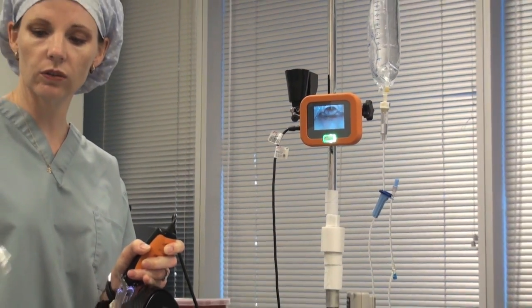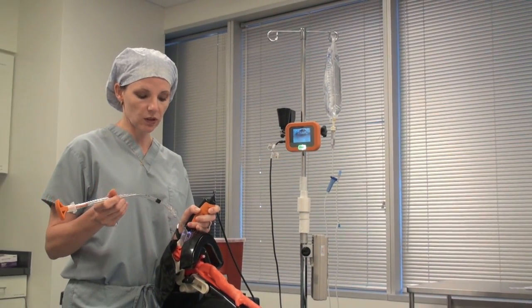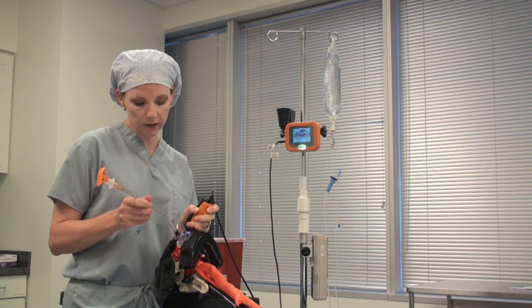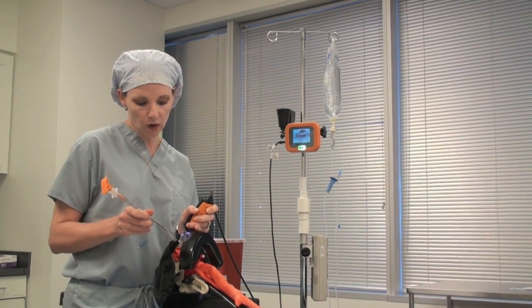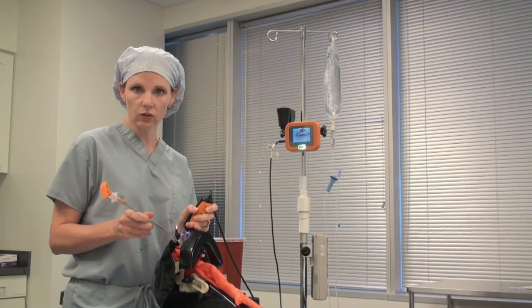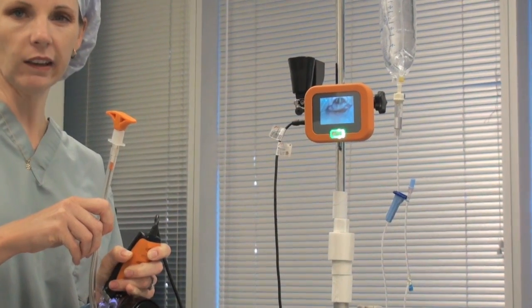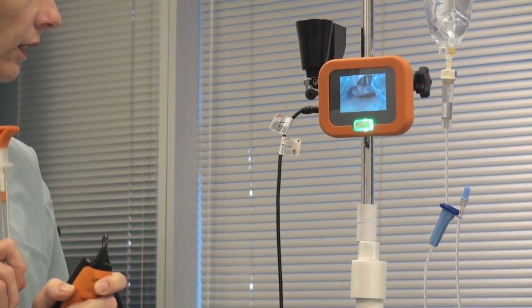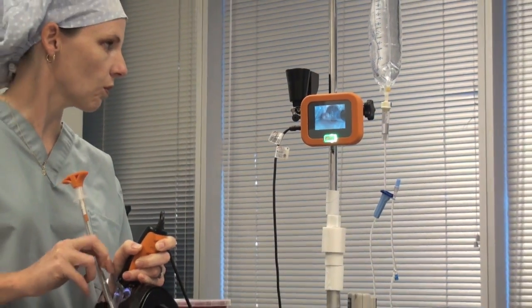Take your endotracheal tube. One method is to place the tube into the patient's mouth at the 3 o'clock position, again watching the tube as it disappears past the patient's back teeth. Once you make it into the oral pharynx, tilt the endotracheal tube up to the 12 o'clock position. You can use a technique that some people call the slot machine technique, and your endotracheal tube will slide between the patient's vocal cords.